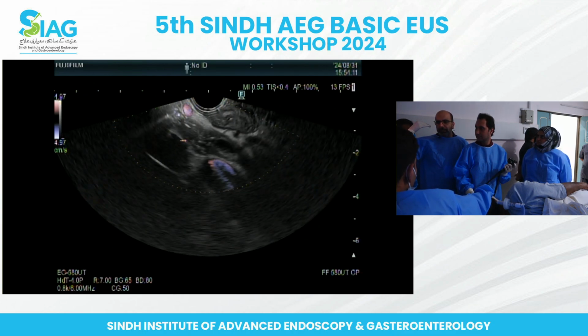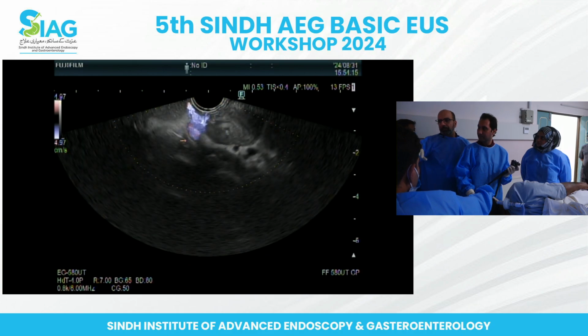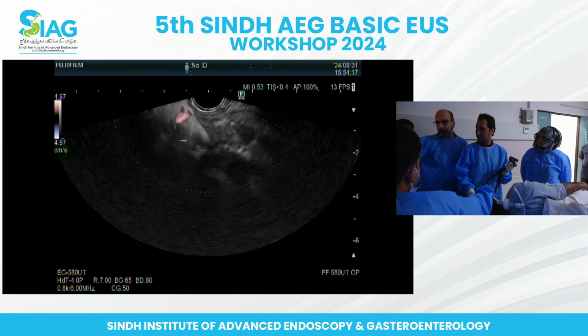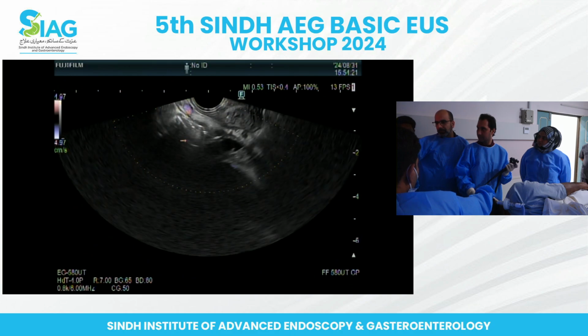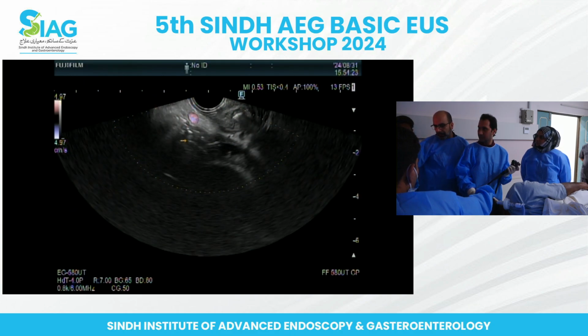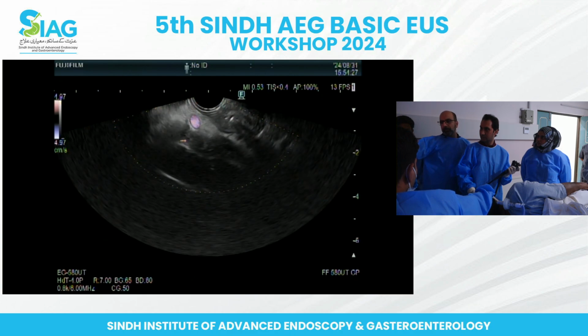Also, you have to keep in mind, what is the purpose of this exam? It's really your ampullary lesion, right? Yeah. So you can do this, and there you go. Now you're going towards liver. There's some debris in there, I think, too, like some sludge. But honestly, we don't want to waste too much time on this because you want to try and see what's going on at the bottom of the duct.